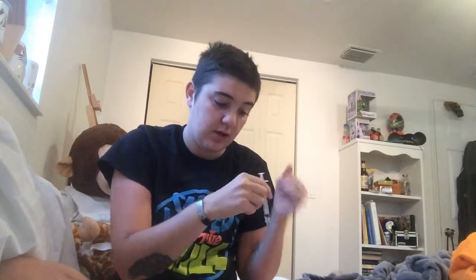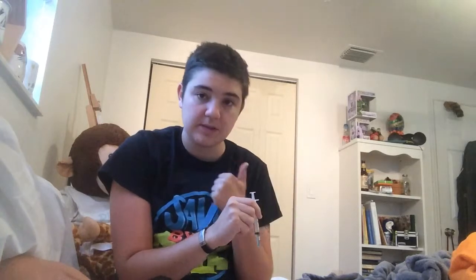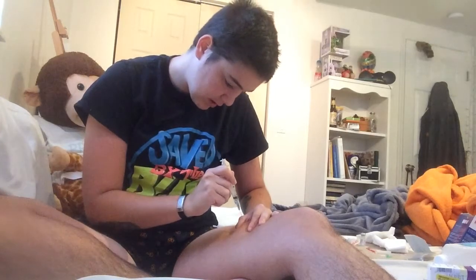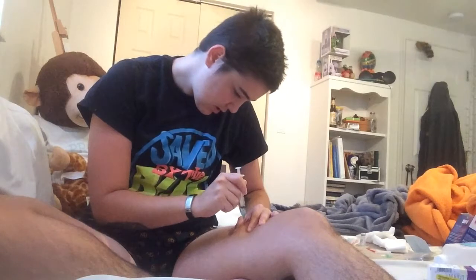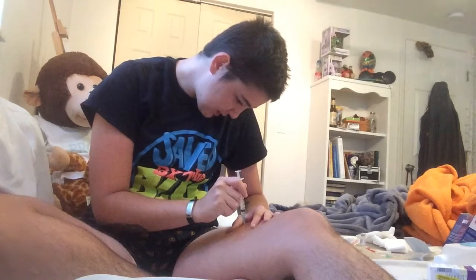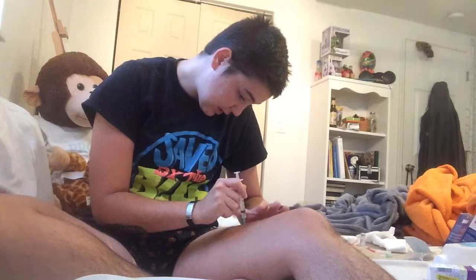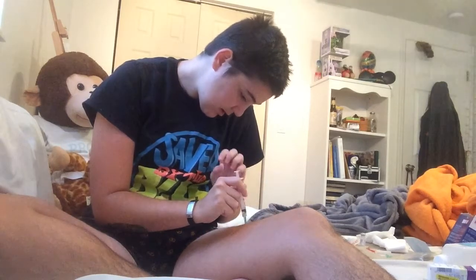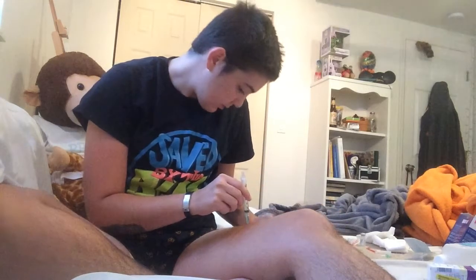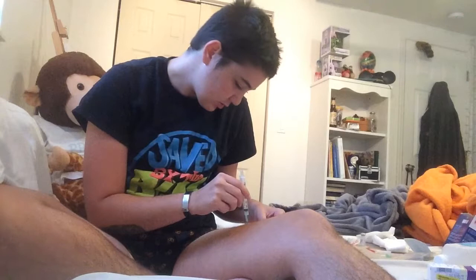And now I just have to pick an injection site. So what I do is I hold it at a 90 degree angle — you only choose one hand to do this, you go straight down and you can't switch hands. It goes a little bit slow because it's a kind of thicker substance. I'm going to pinch the area with my left hand and inject with my right, and I'm just going to go at a 90 degree angle straight in. I want to make sure it's all the way down. And I'm going to look for blood — there isn't — which means I didn't hit a vein. You never let go with the hand you're injecting with, but I can let go with the hand I'm squeezing, that way I can start pushing it down. I like to hold it for an extra three seconds just in case there's anything left in the needle. But I already have my bandaid prepped, so I'm just going to wait.